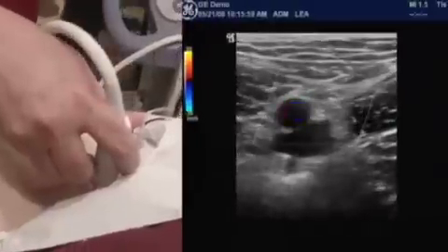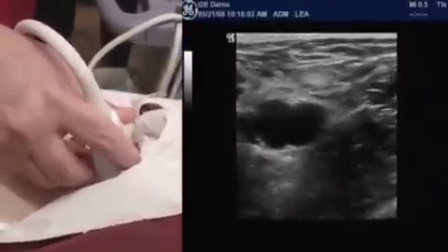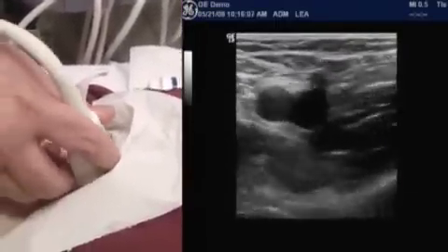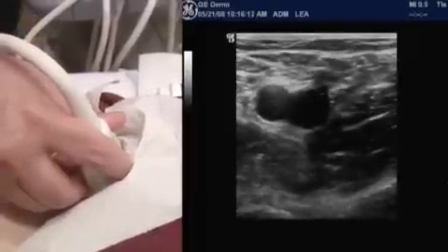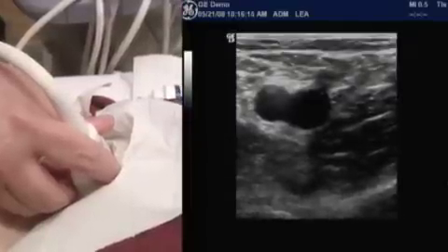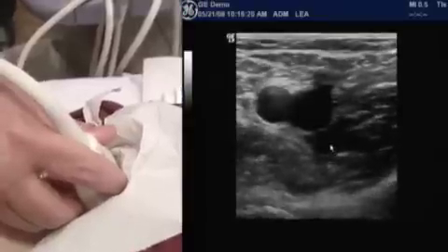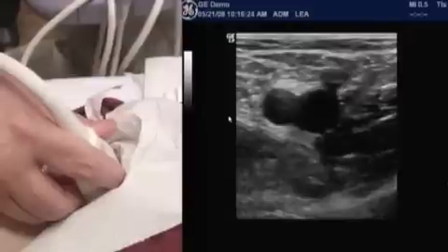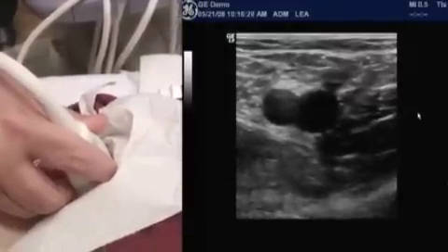I usually just start with a transverse view, right pretty much as high up as I can, and try to find the saphenofemoral junction, which, let's see, let me just bring up a trackball, or the arrow, the cursor. Up here on the screen, you can see we have this oriented, obviously, so the patient's right is on your left, and the patient's left is on our right.